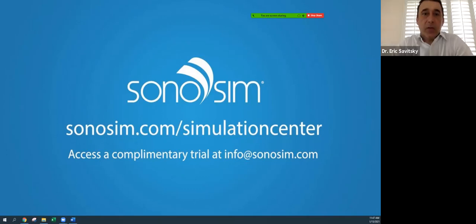Kathleen's question was, so with AI assessments, will that automatically score with feedback on the scanning cases in SonoSim? Yeah, and I'll be happy to revisit that and just go through the chat box. So the AI assessment version 1.0 will provide feedback regarding whether an acquired image is acceptable, unacceptable, or indeterminate. With respect to acquiring an optimal image, the view is determined by ultrasound subject matter experts, and image depth and image optimizations such as gain will be similarly assessed and reported. The cases that will be assessed come from each SonoSim module and sample assignment that tasks the learner with executing critical tasks that are taught in corresponding SonoSim courses within each SonoSim module.